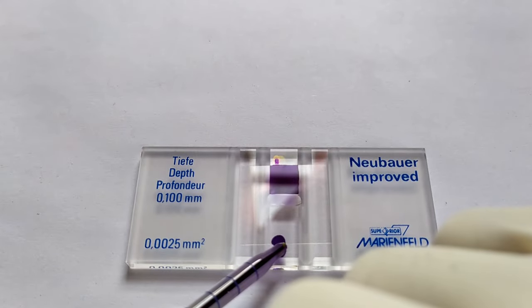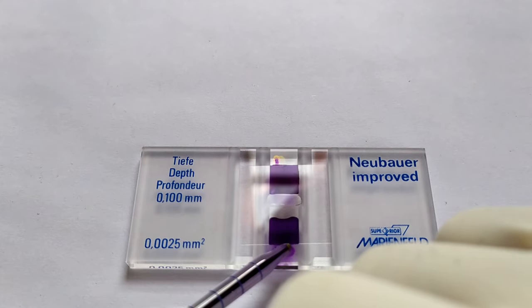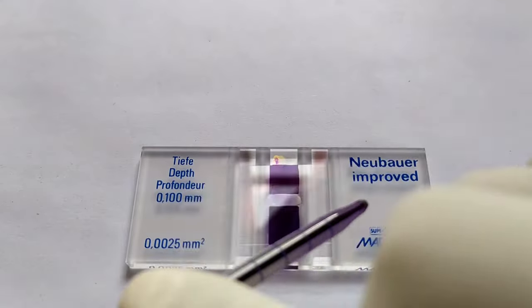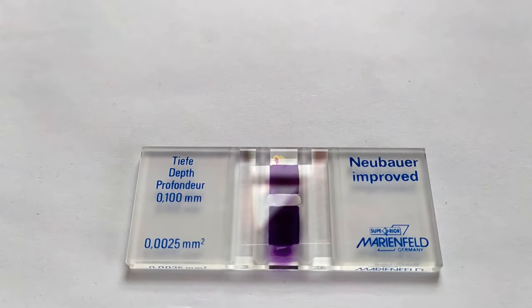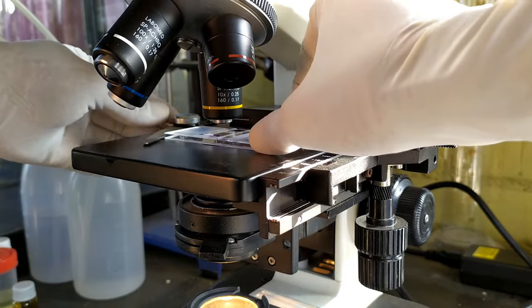You may load the other counting chamber as well in a similar fashion. Once you're done loading the chambers, keep aside the counting chamber for a few minutes to allow the WBCs to settle. The slide is now ready for microscopic observation.